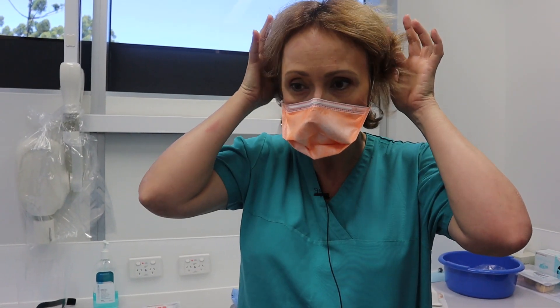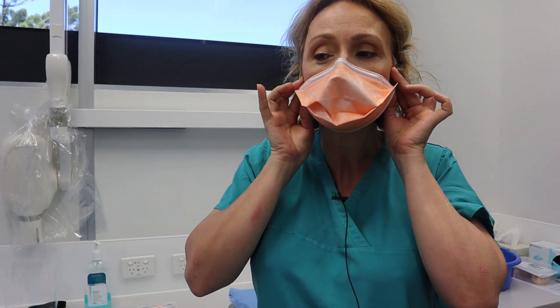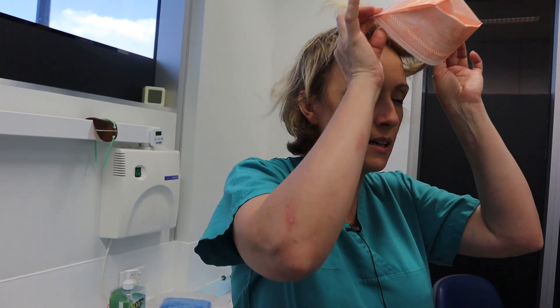To remove the mask, grab it on the side and move the strap up. Then with both fingers grabbing the mask, taking it away from the face, pull the mask up and over and out.